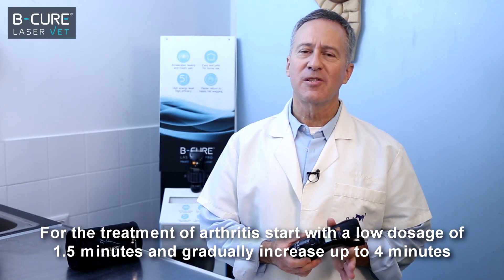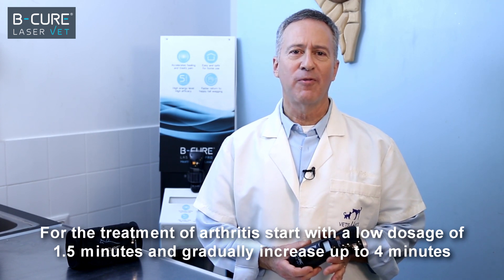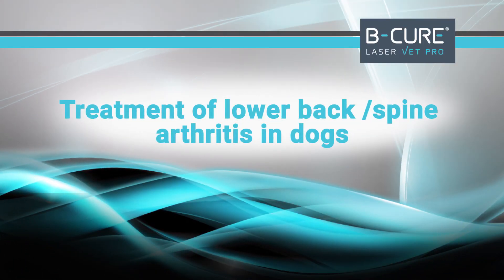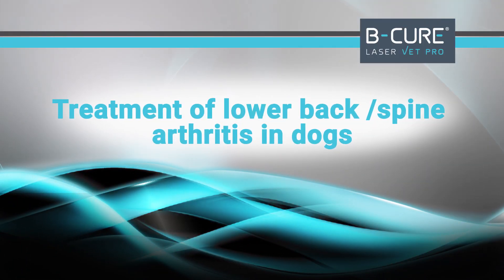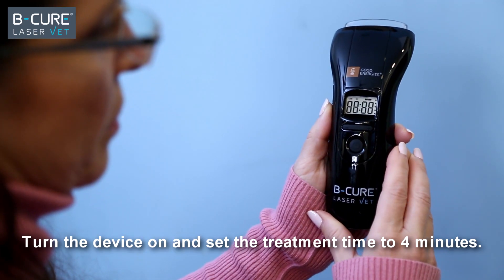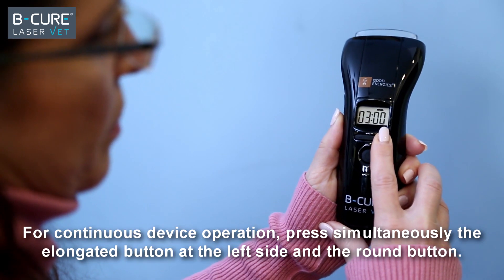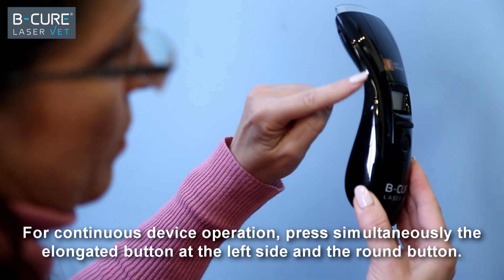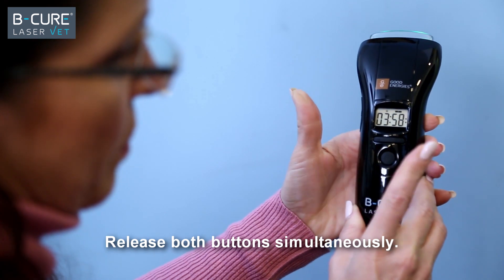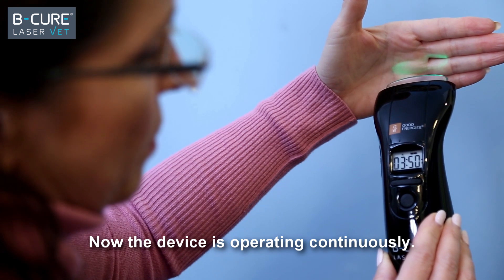For the treatment of arthritis, start with a low dosage of one and a half minutes and gradually increase up to four minutes within 24 hours. Turn the device on and set the treatment time to four minutes. For continuous device operation, press simultaneously the elongated button at the left side and the round button, then release both buttons simultaneously. Now the device is operating continuously.